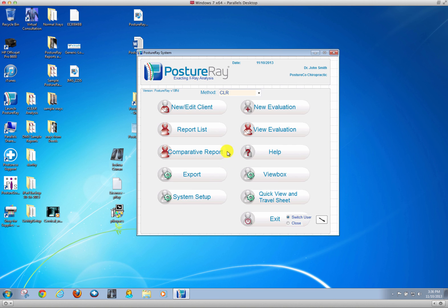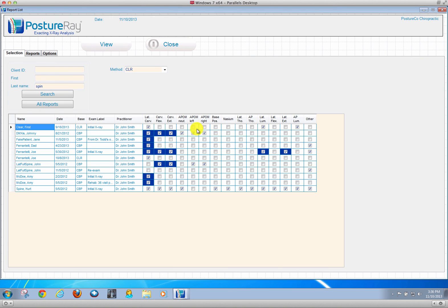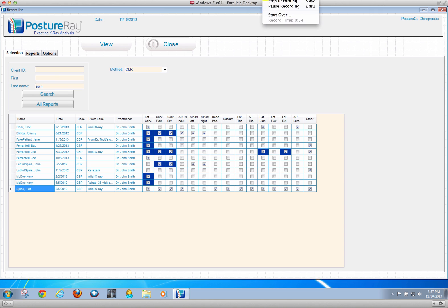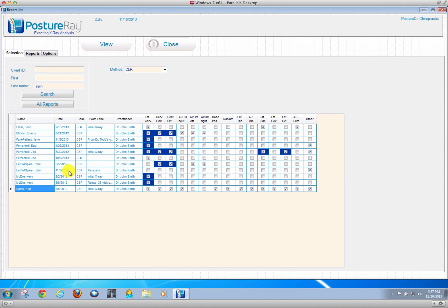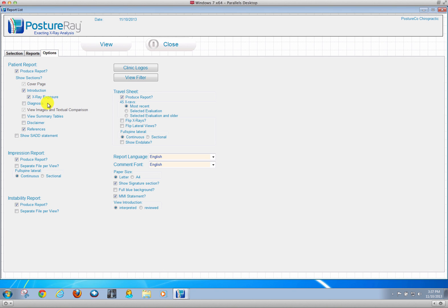Let me show you how easy it is to generate a report. You just go into report and click right here. The next step is to simply select the patient. We have the patient selected. What options do we want to put in the patient's report? Everything else is doctor's report. And then we just hit view.